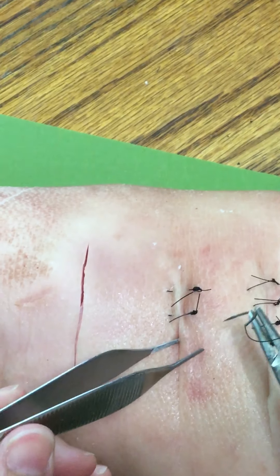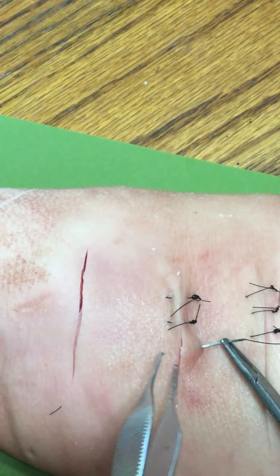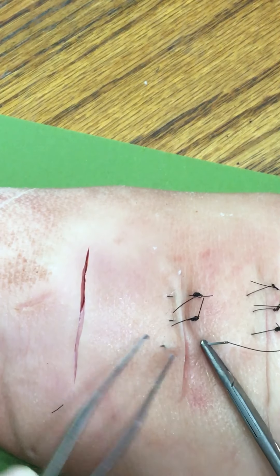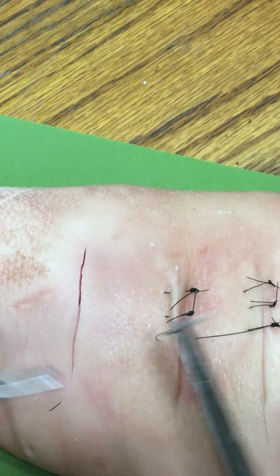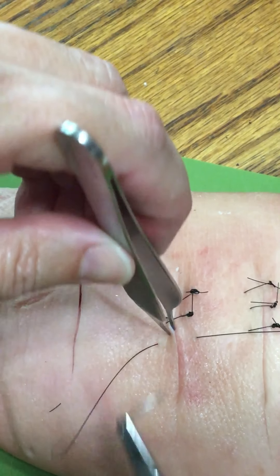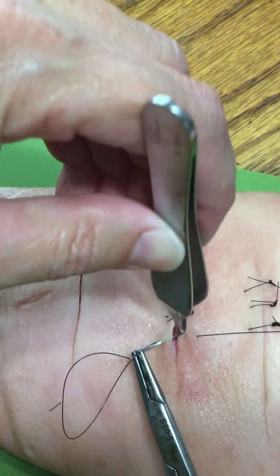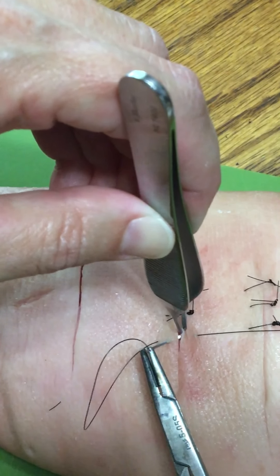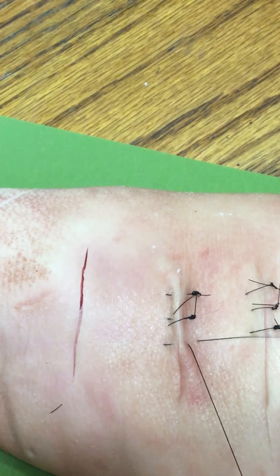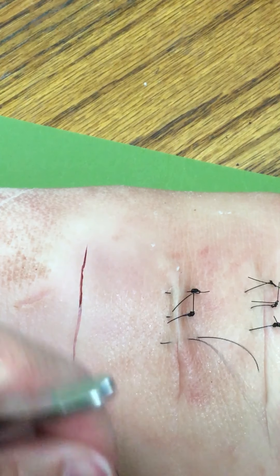I'll do one more here. Entering at 90 degrees deep. I'm going to reload that backhand. Half the distance — I'm going to come out just sub-Q for my shallow stitch. One, two.